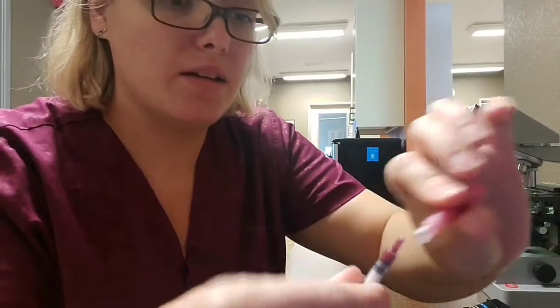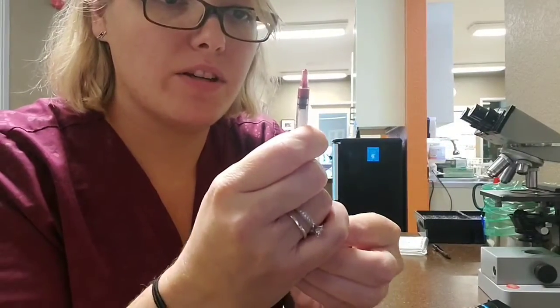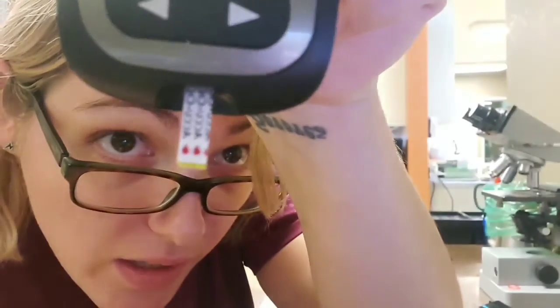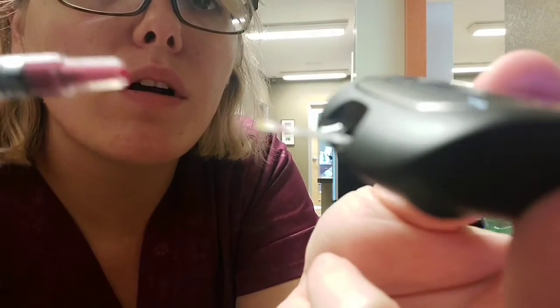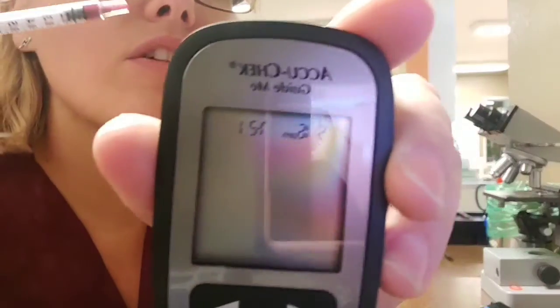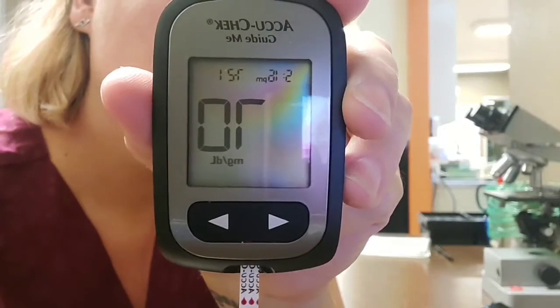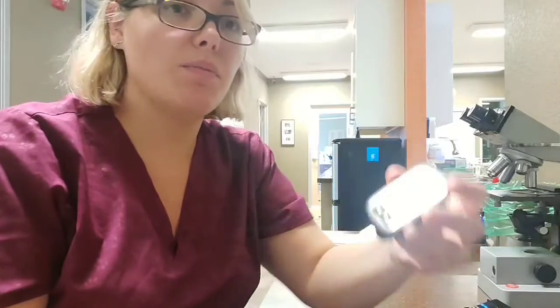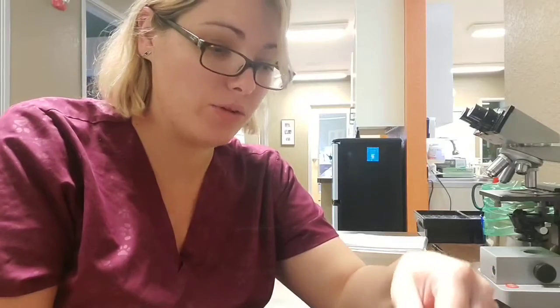So I'm just going to take my needle off here. Make sure we're good towards the end. And there's a little yellow gold area, I don't know if you can see it, and that's where we are going to put our blood. And then it should start to read. All right, so blood glucose is 70. Typically, this is on a cat, so we would be between 80 and 120 for normal blood glucose levels. So this is a little low, but that is essentially how you perform a blood glucose.